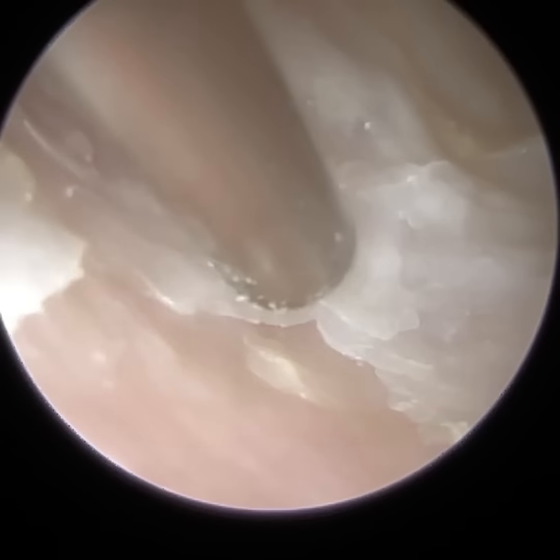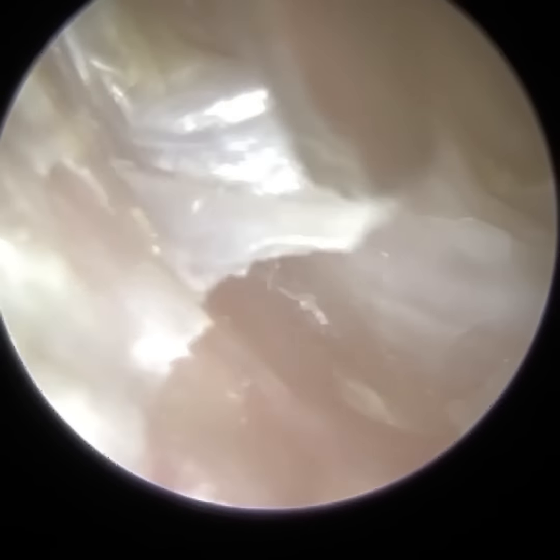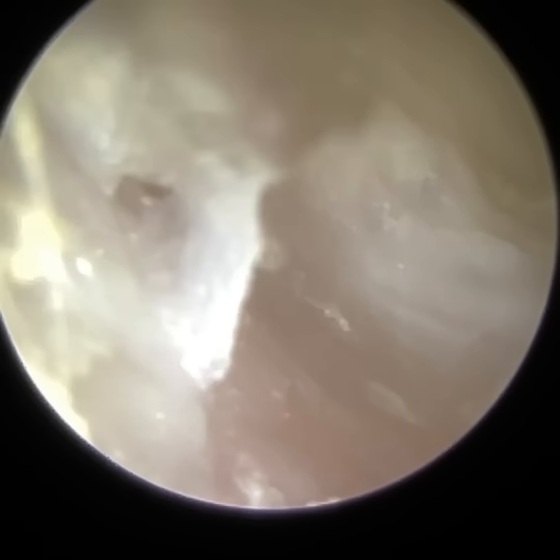So I must admit, when the skin does come away like this, there's something quite satisfying about it. And I know a lot of viewers feel the same when you see skin being peeled.